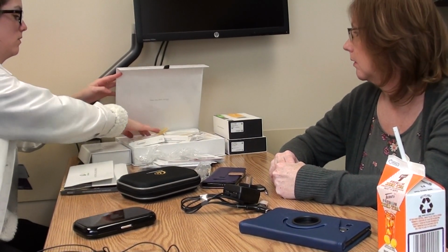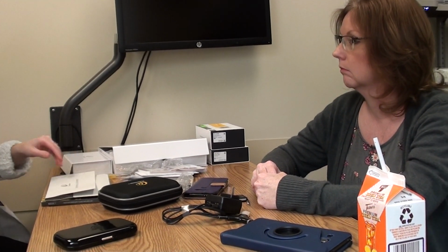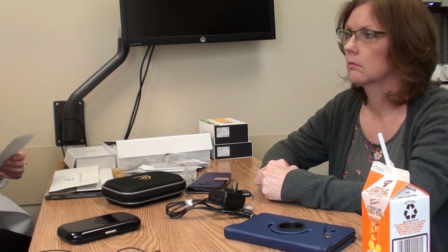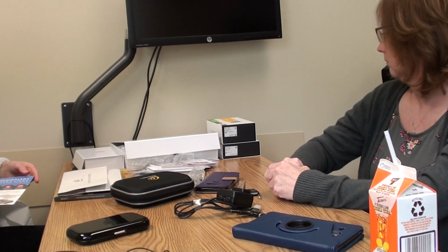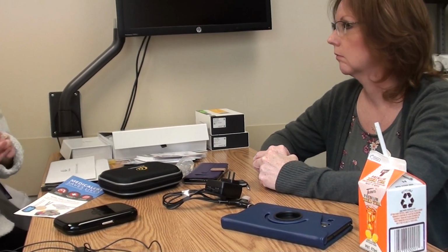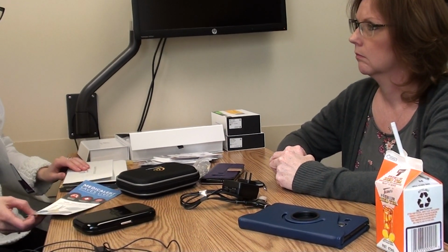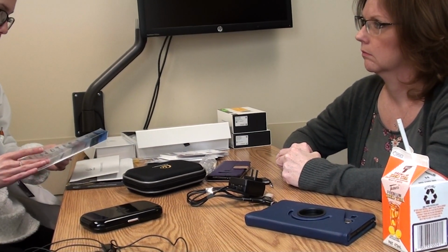Let's do this. When we were here before, you mentioned something about an adapter to go on her cell phone later. Yeah, so that's those two boxes right there. She has the mini microphone, which is the device you would wear to talk into, and her phone clip, which is the cell phone adapter. I'm going to put those in her bag so that you have them, and I want you to take them home and charge them, which we'll show you how to do. But we're not going to talk about those today.